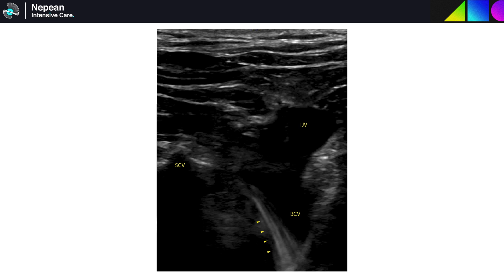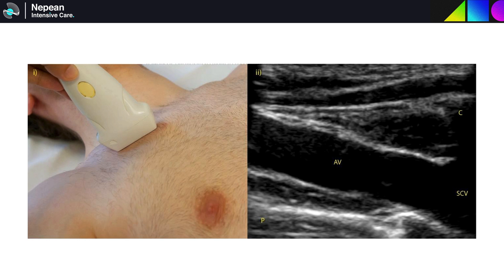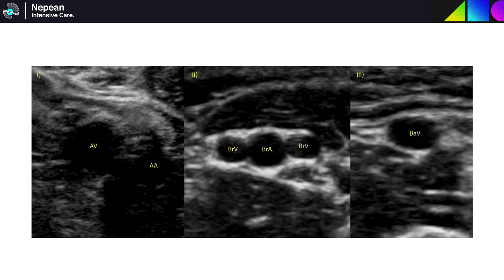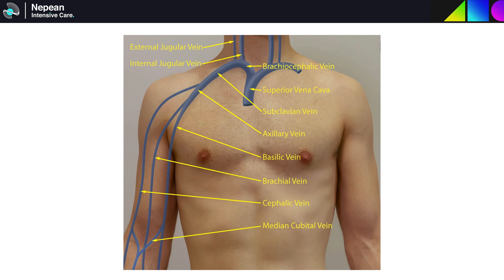Here you can see a wire passing from the subclavian vein into the brachiocephalic vein. In the infraclavicular region, the axillary vein can be seen passing underneath the clavicle — also potentially a good in-plane view for infraclavicular subclavian or axillary cannulation. The axillary vein can be followed into the axilla and then seen to divide into the basilic and brachial veins. Here you can see the paired brachial veins in the middle with the brachial artery. It's important to try and compress sequentially along this system, though clearly there are some areas where this is not possible.